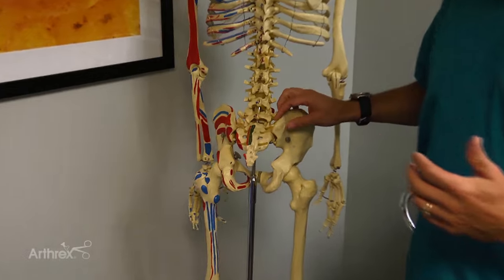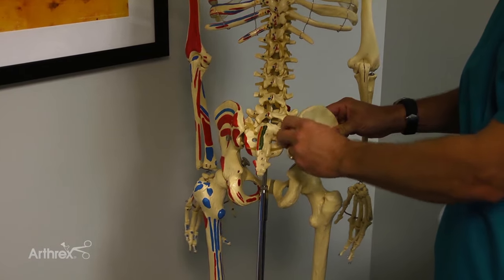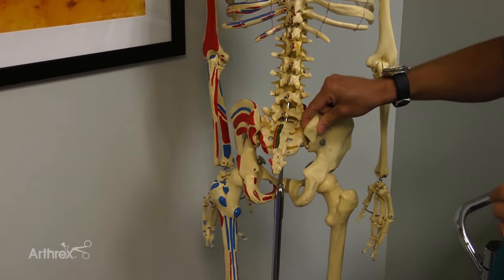When we're looking at getting bone marrow draws, the easiest place to get bone marrow and the largest aspirate site is going to be from the pelvis, from the iliacus here, the iliac bone.